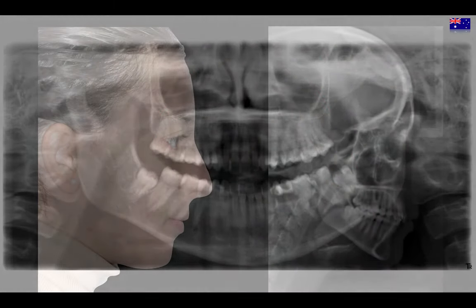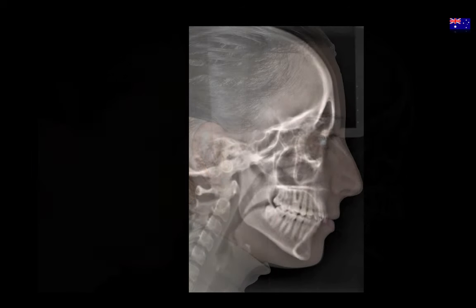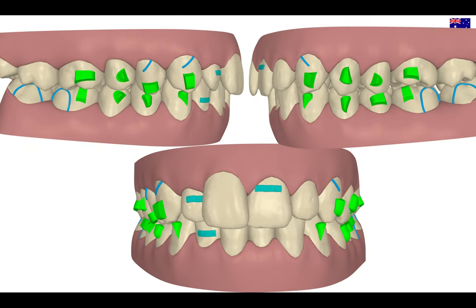You can see that we have the wisdom teeth in the mouth. The protocol I'm going to use to solve this case involves expanding both arches in a coordinated way. I'm going to maintain the wisdom teeth because I'm going to use Class 2 elastics and also Class 1 elastics in the upper arch — an elastic going from the infra-zygomatic crest screw to a hook in the upper. The patient is going to use both Class 1 and Class 2 elastics — Class 1 for effect in the upper arch and Class 2 to allow the mandible to advance.